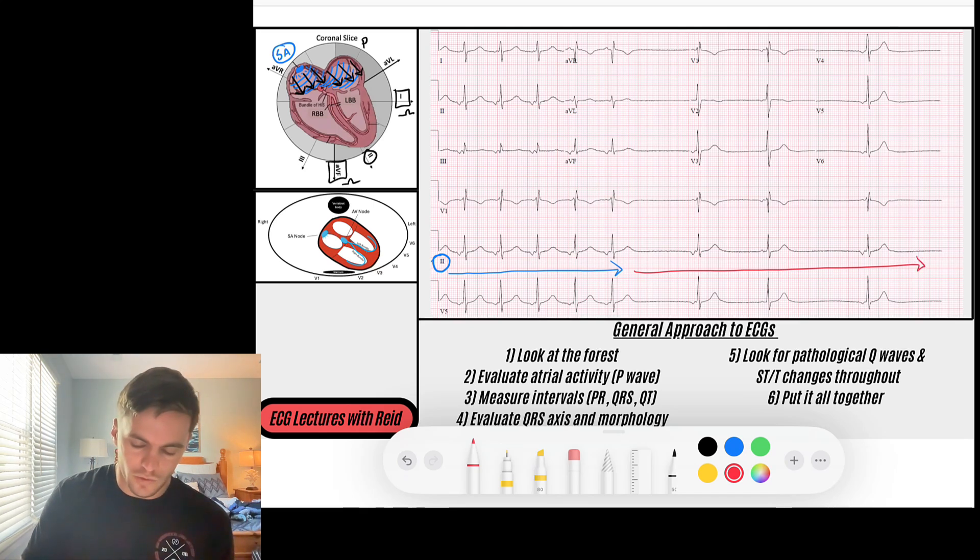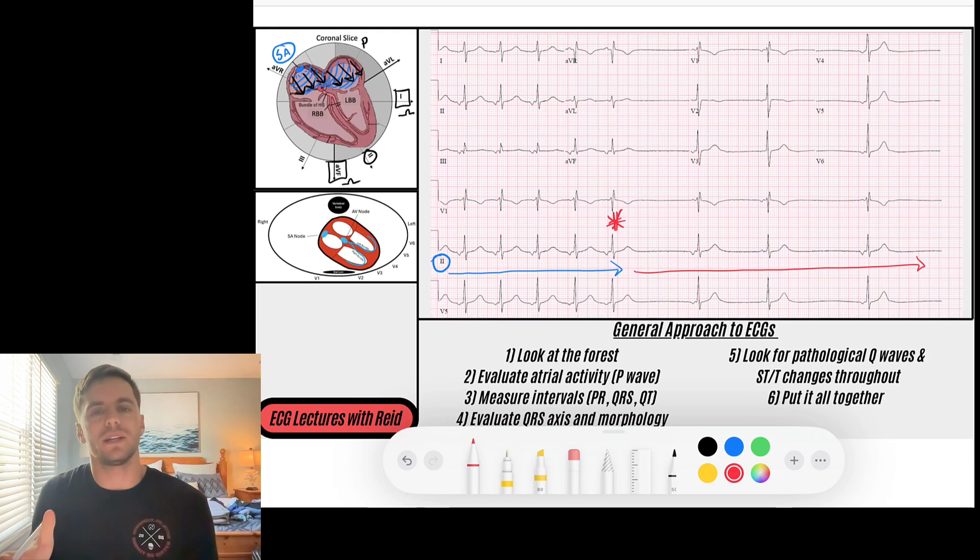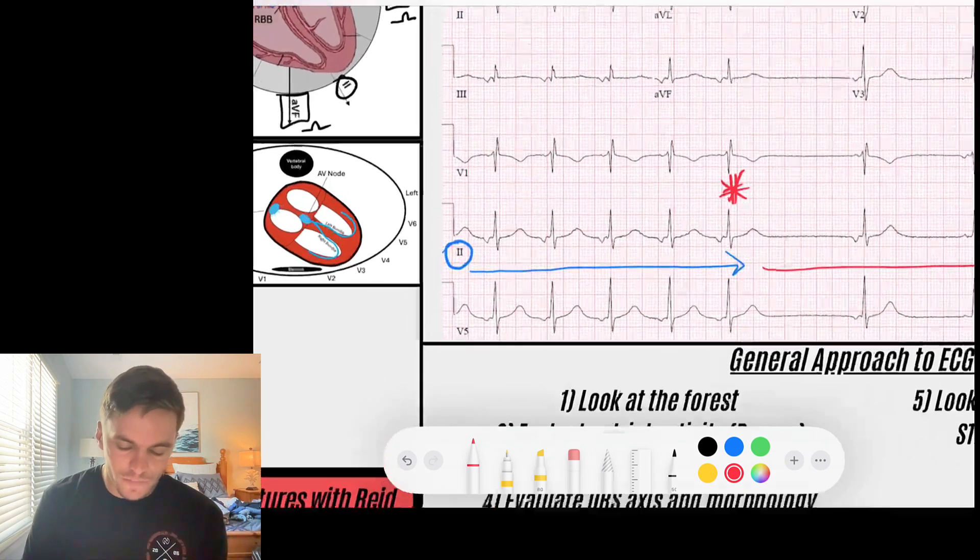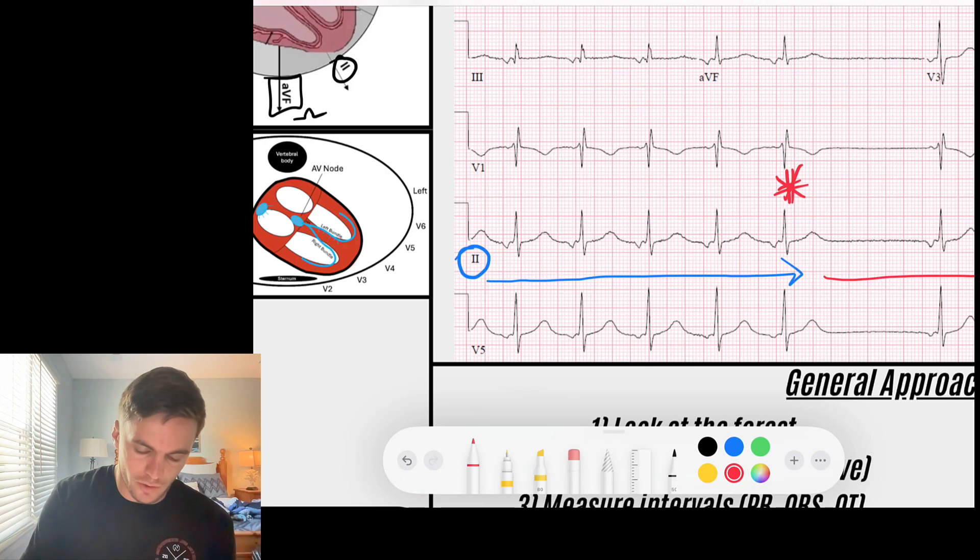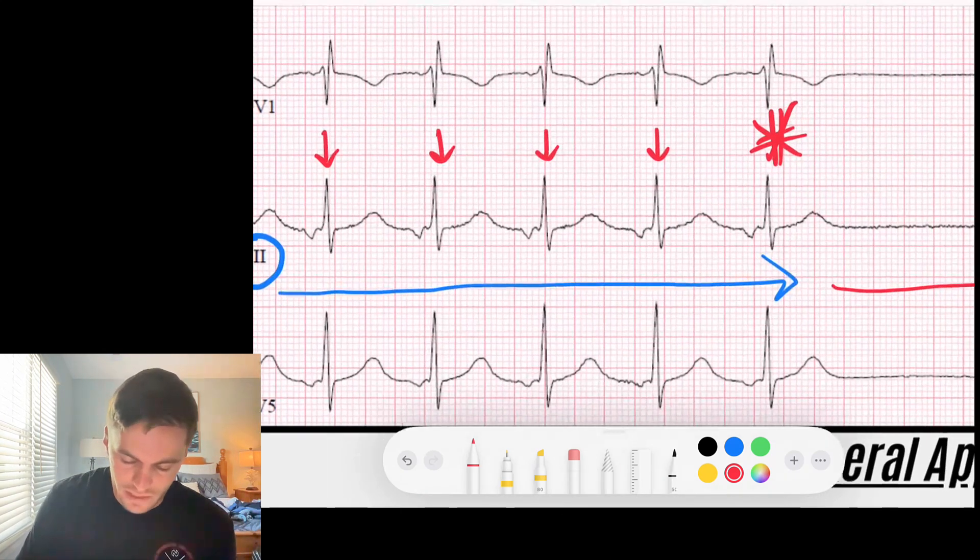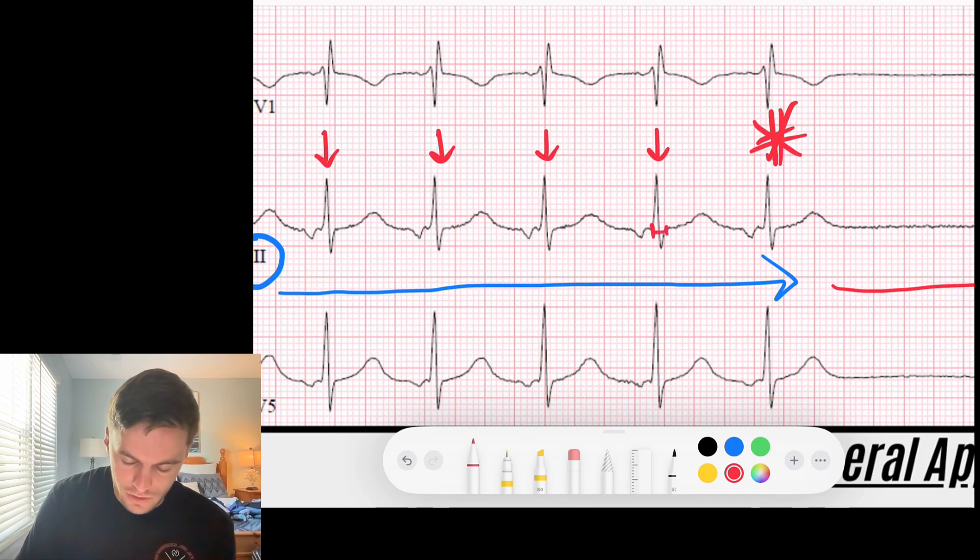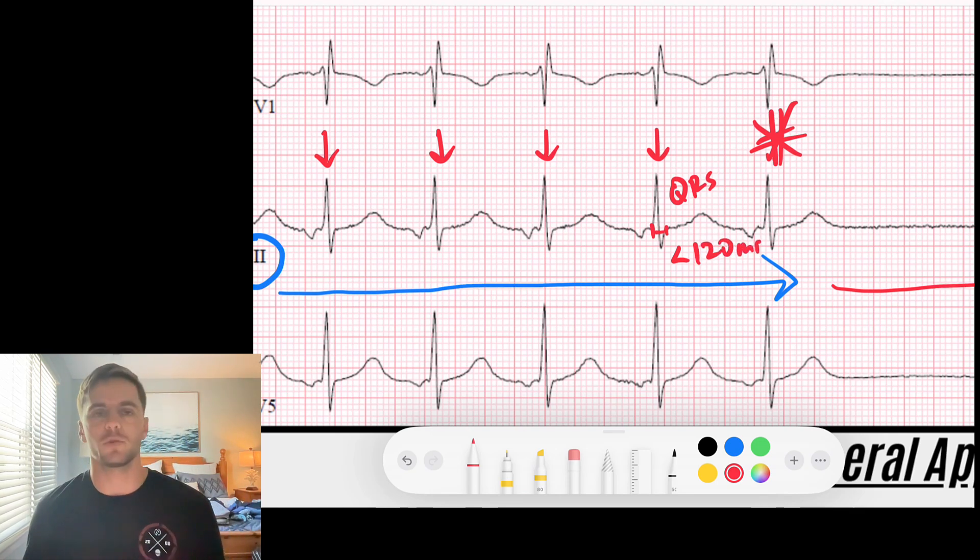Let's take a look at this EKG and then we'll dive into the mechanisms. First thing I'm going to notice is when I initially look at this rhythm, maybe I look down here at lead two, I notice that initially it seems to be a nice regular rhythm, and then all of a sudden the remainder of the rhythm is very slow. So I want to know what changed right here where this asterisk is—what changed? So what happened before and what happened after?